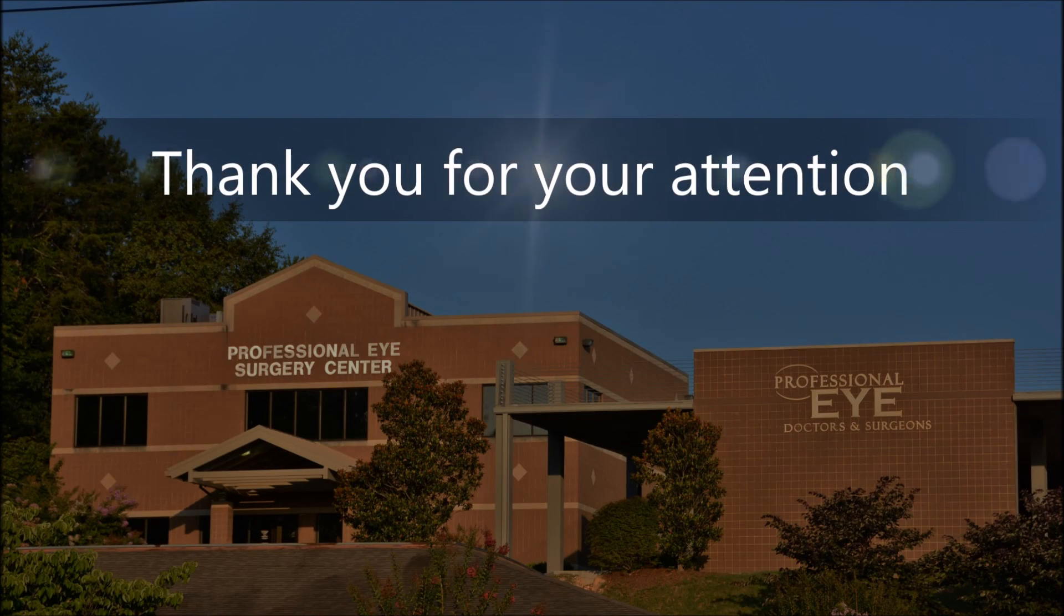Again, you want to place the tip upside down. You want to make sure that tip is holding that lens material on the surface of the lens. Apply diagonal vector forces, and you should be able to divide denser lenses for your double chop technique.